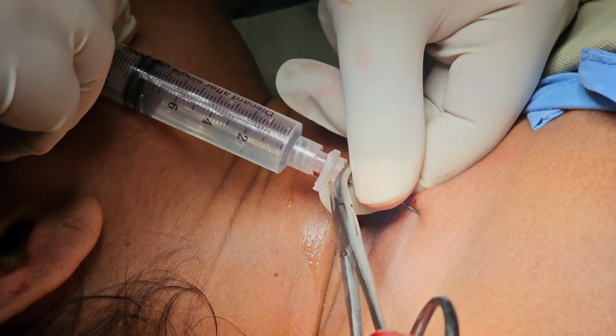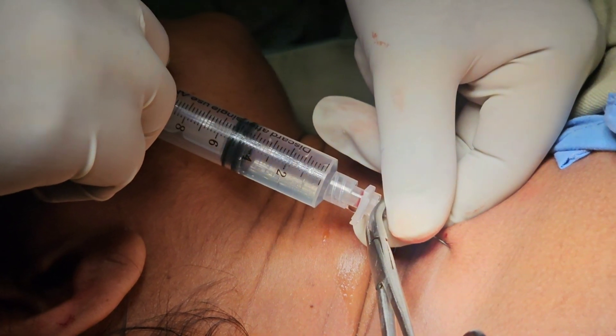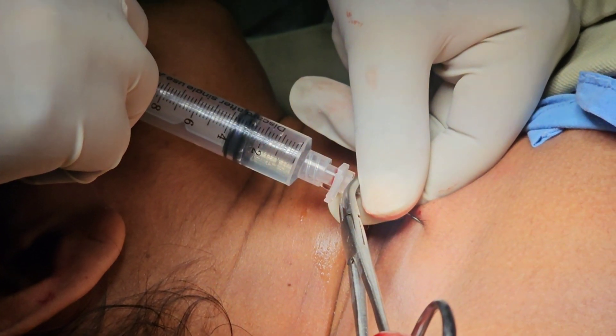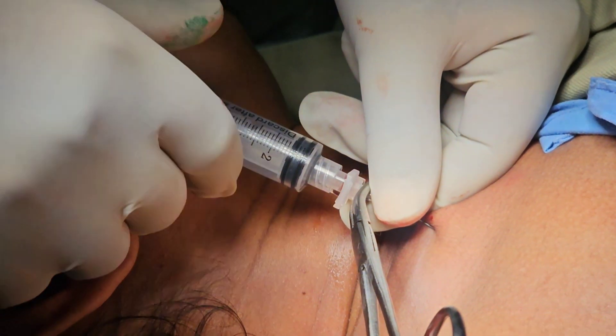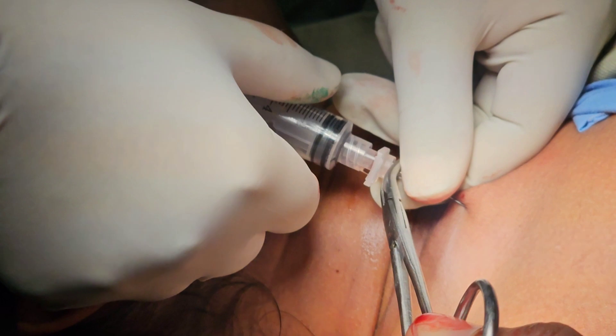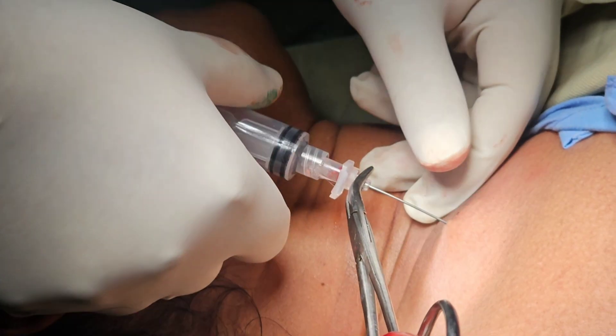The highest toxic dose of bupivacaine used here is 2 mg per kg body weight. For this patient at 50 kg, the maximum dose is 100 mg, so we used 90 mg. After that, we used lidocaine, for which the maximum dose is 3 mg per kg body weight.